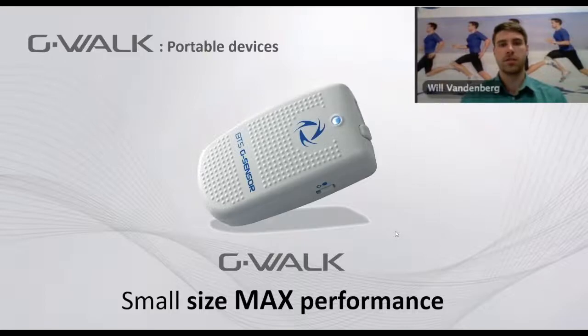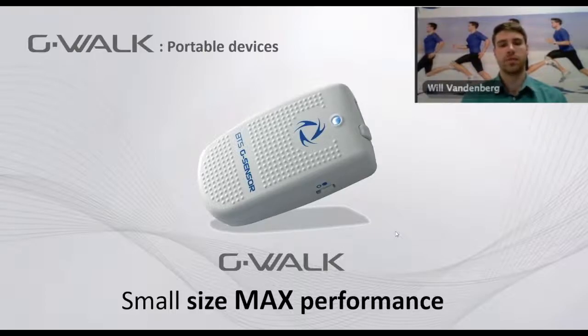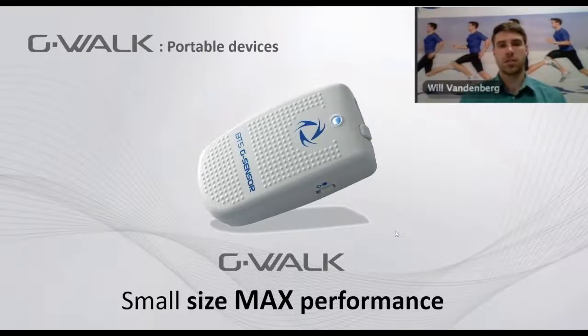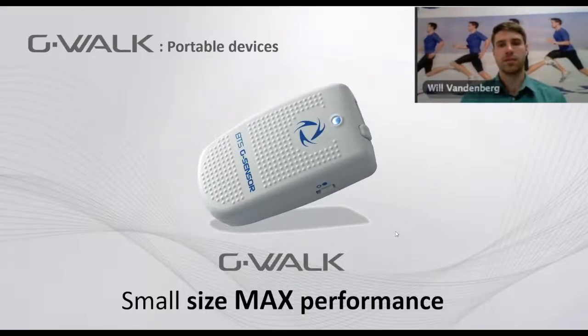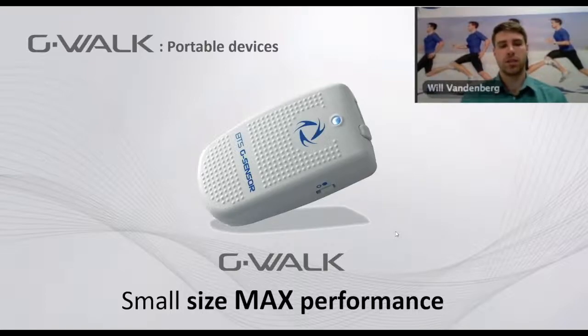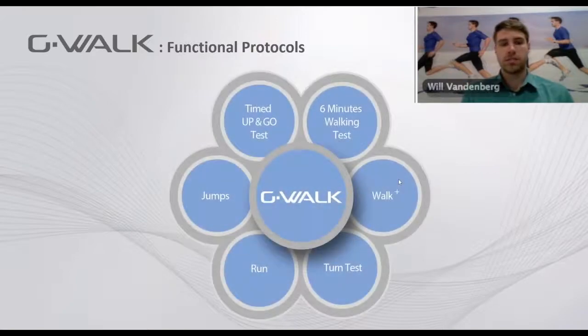It's quite small in size. It measures about 70 millimeters by 40 millimeters by 18 millimeters and weighs only 37 grams. The G-WALK system can perform and analyze six different commonly used clinical tests.